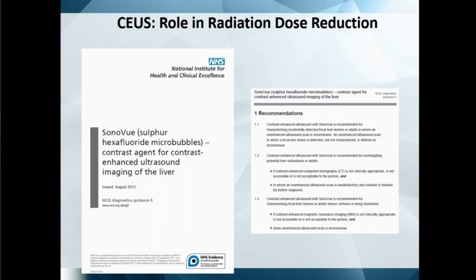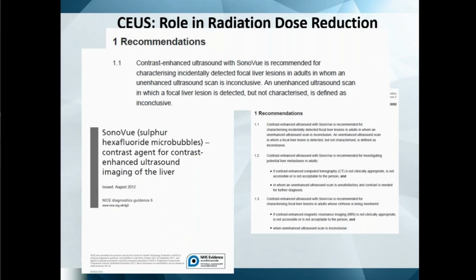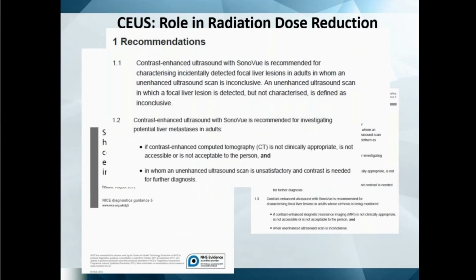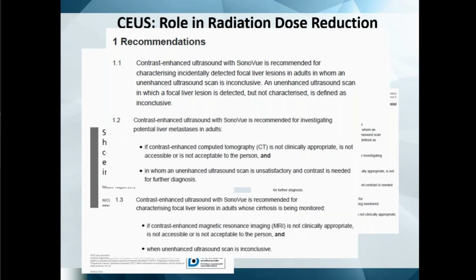In Great Britain, we have the National Institute for Health and Clinical Excellence, NICE, and they recommend that we use contrast-enhanced ultrasound in different scenarios wherever ultrasound is inconclusive, if the patient doesn't want to have or cannot have CT, and also in the evaluation of HCC.